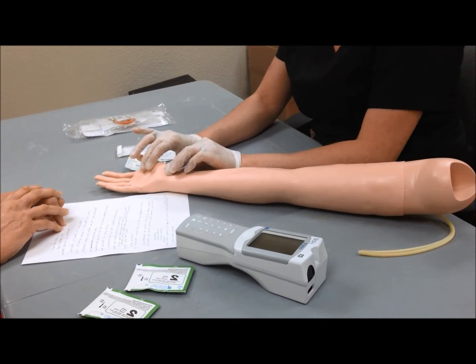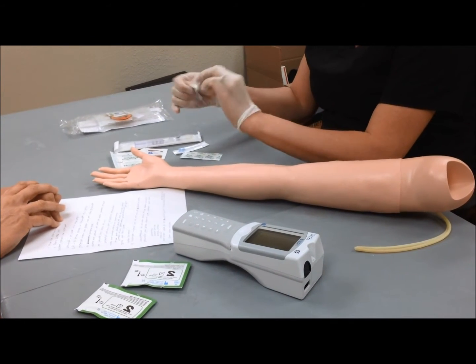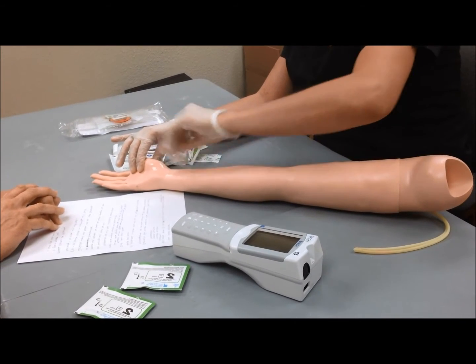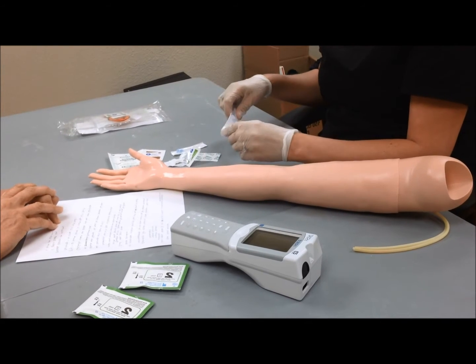Once you have found the best pulse, you need to swab that area with an alcohol pad. Then you will take your syringe out.